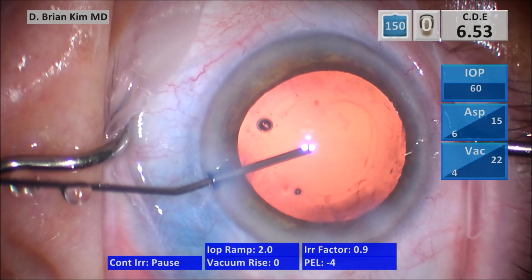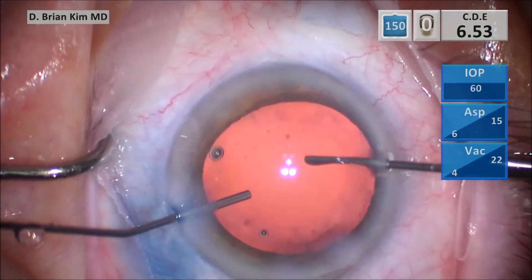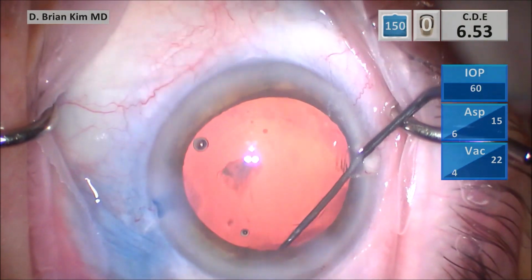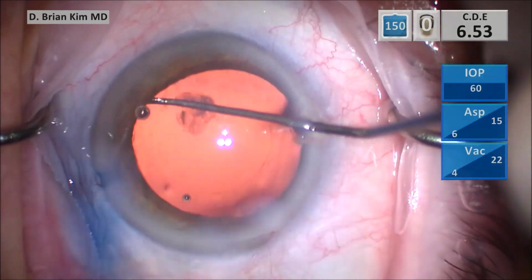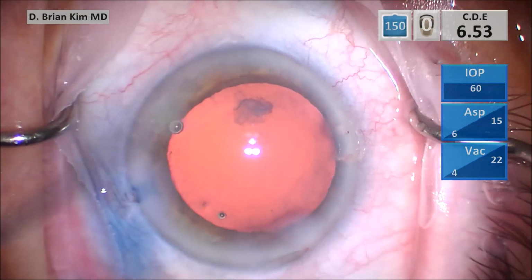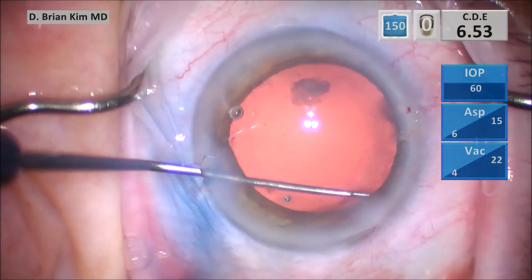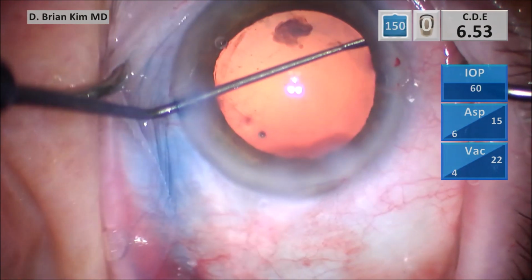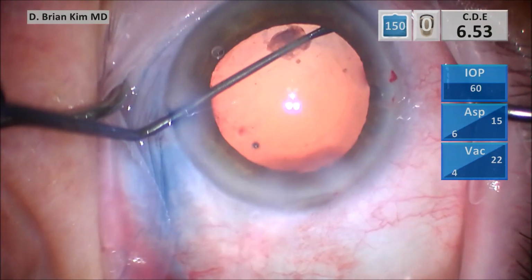So go ahead and push the cohesive viscoelastic. And then I'm using the sweep, and you can see there is a little bit of lens material there, but it's soft lens material. This is the other way. If you're having that convex appearance of the posterior capsule, going in with the cohesive viscoelastic and doing the sweeping position does allow you a very, very controlled way to polish underneath the rexis edge.